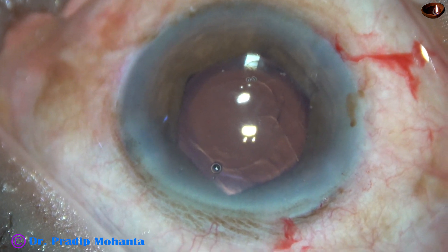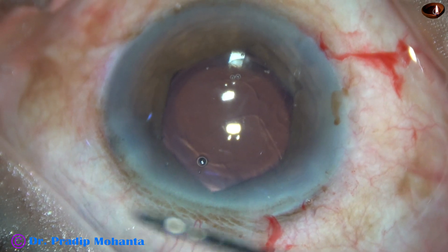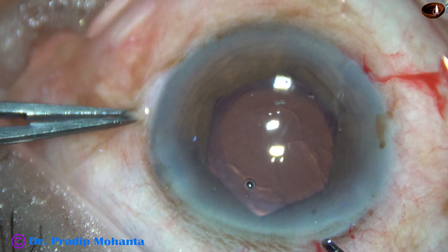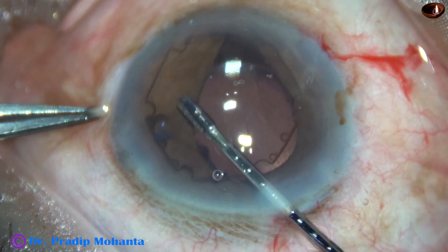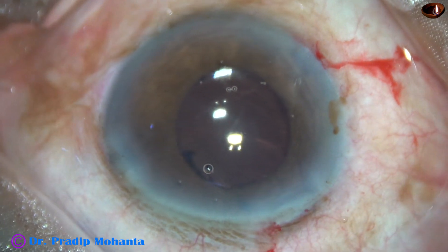Now is the time to remove the Bhex — shown here in slow motion. This flange is held and pulled centrally, then go near the angle. All the flanges disengage and it is pulled out.